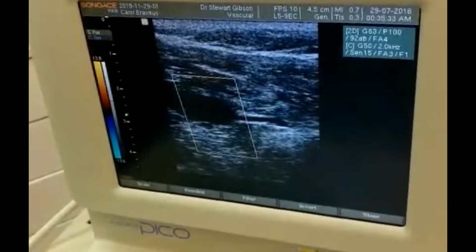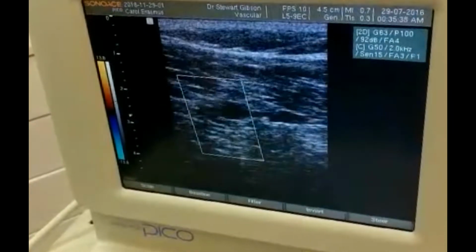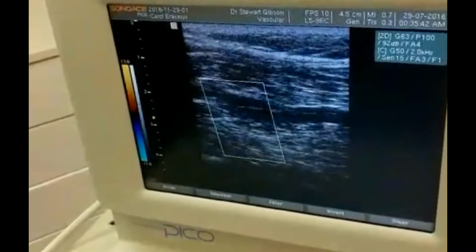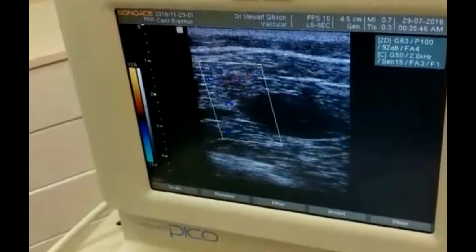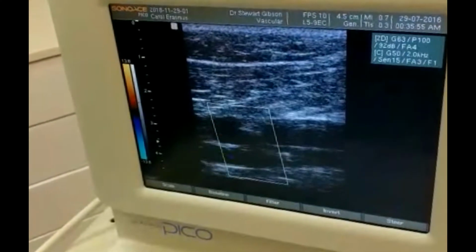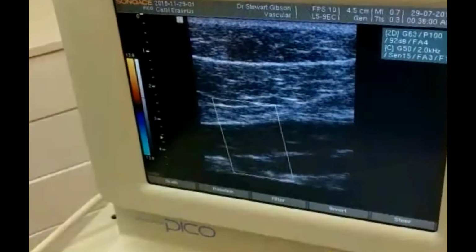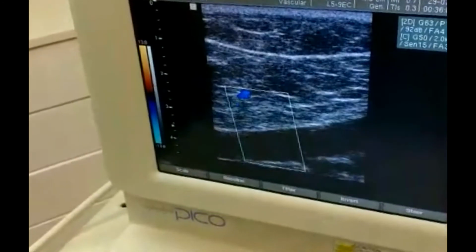What we see in the popliteal fossa is a deep venous return with possible varix formation, nice and bulging. We notice that the deep circulation is patent, and I can't find any obvious reason as to why there should be such a high venous return.